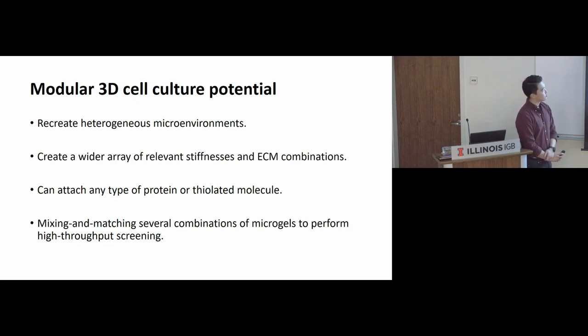And with these microgels, of course, you can create a wider array of relevant stiffnesses and ECM combinations. I do acknowledge that the 10 kilopascal is not a great soft environment, but you can see a future where we just keep modifying the component of the gel, lower the stiffness, so it's more healthy organ stiffness. And not just ECM, you can attach any kind of thiolated protein or any molecule. It could be a drug, it could be anything that you can think of. And as I said, you can mix and match them and then create different environments for whatever you're trying to study.